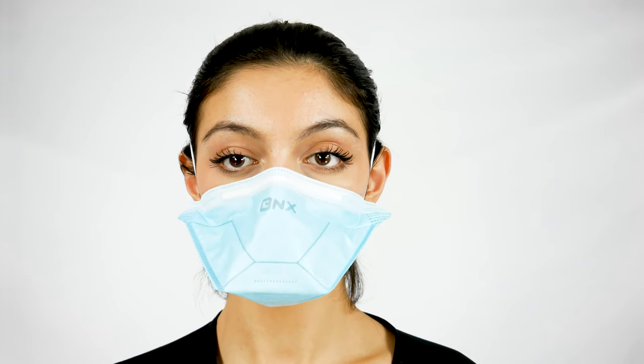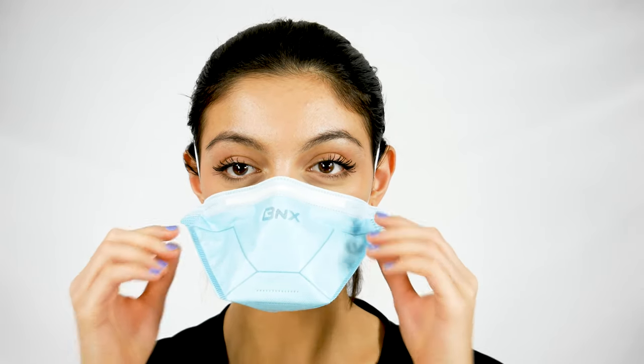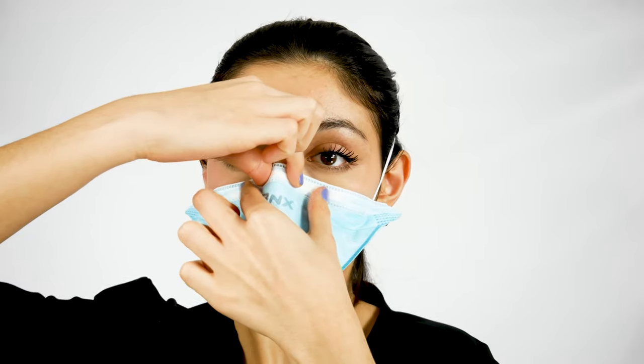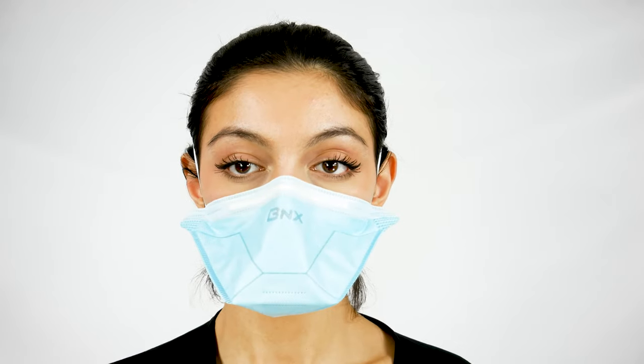Ensure a snug fit. Perform a seal check where you breathe in and out forcefully a few times. Make sure there is no leakage around the edge of the mask. If there is leakage, you can readjust the mask and pinch the nose piece along the bridge of your nose. Then perform the seal test again.